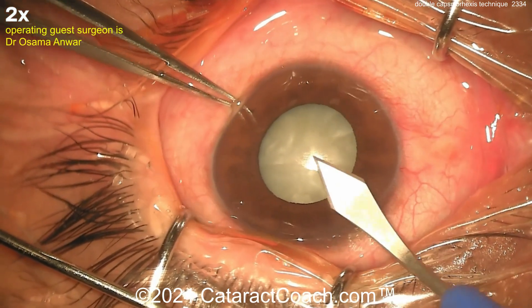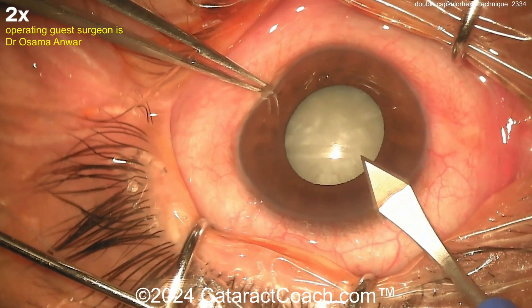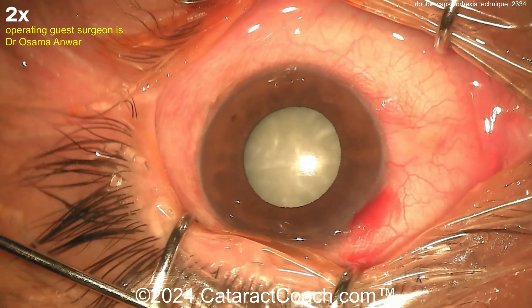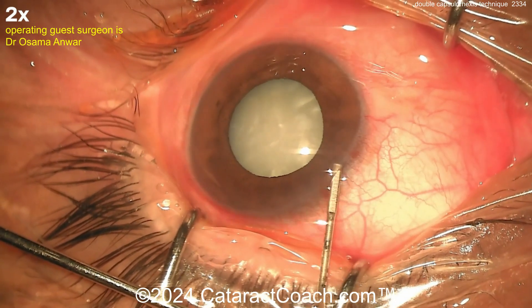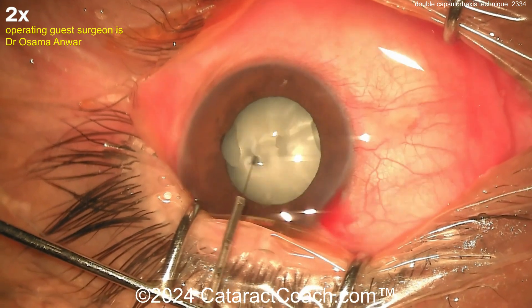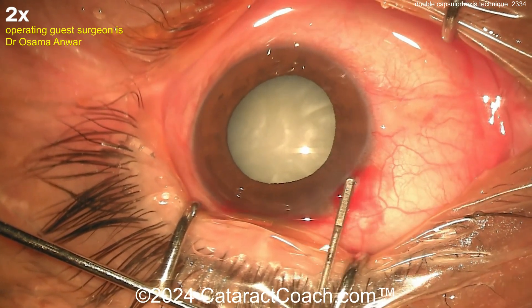We've sped the video up. Our guest surgeon is going to do a great job. Look at that main incision being done. I like the draping — beautiful on the draping. Eye's in good position in primary, and probably some anesthetic going inside the eye here. That'll help dilate the pupil too — maybe some epinephrine or phenylephrine in there.